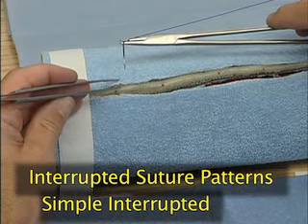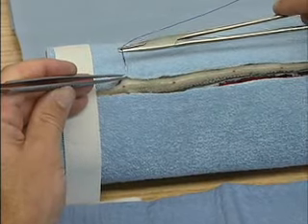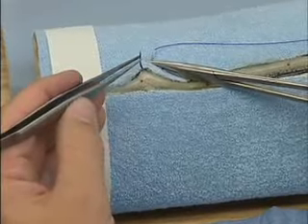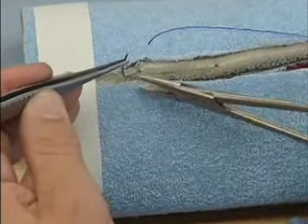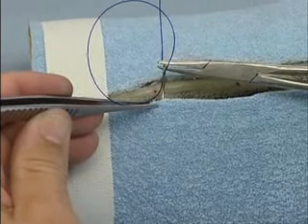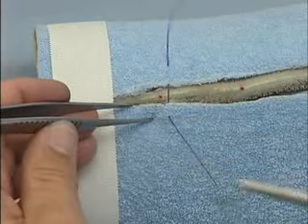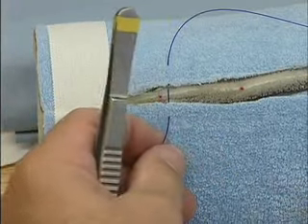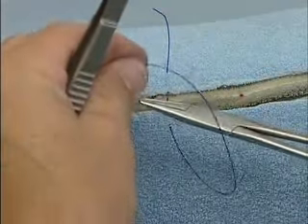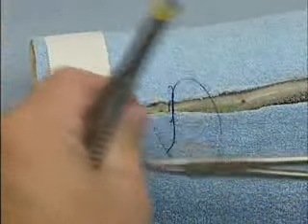We'll do single interrupted skin sutures. The skin is grasped at the edge, the needle is placed adjacent to the forceps, and the curve of the needle is used to bring it through the skin. The skin is grasped on the opposite side, the needle is passed through, and the suture is tied.